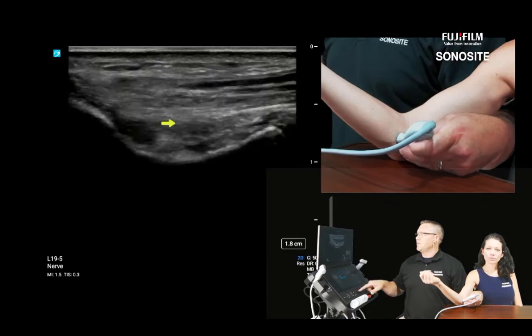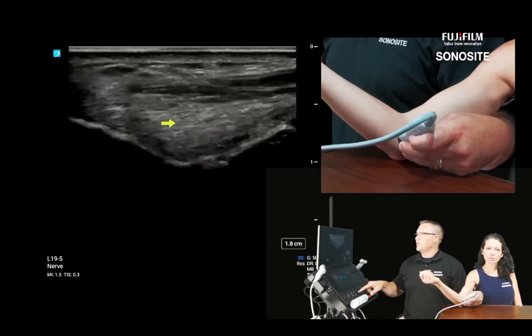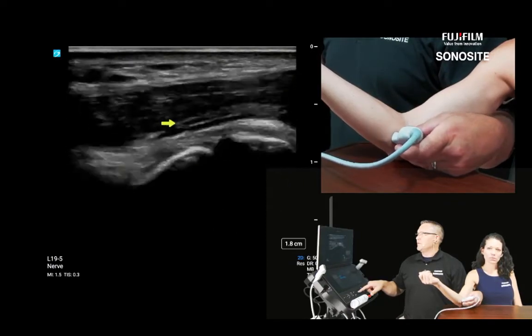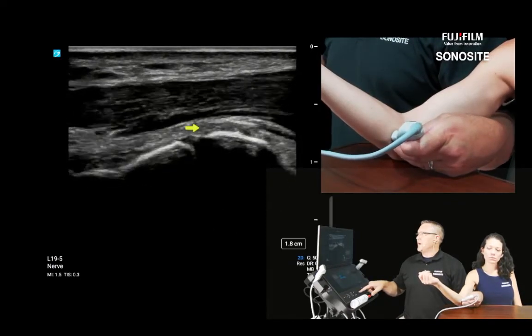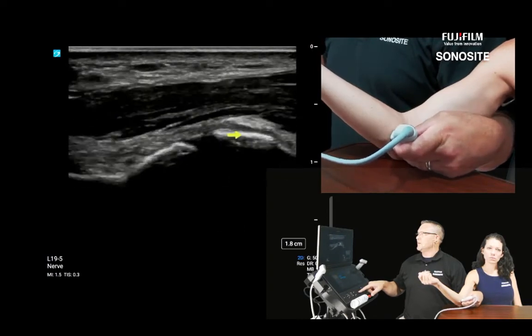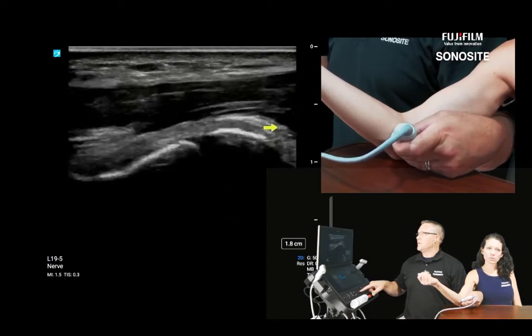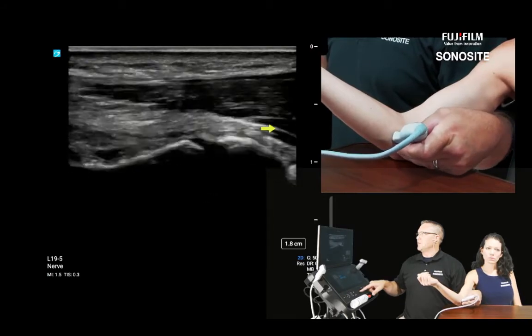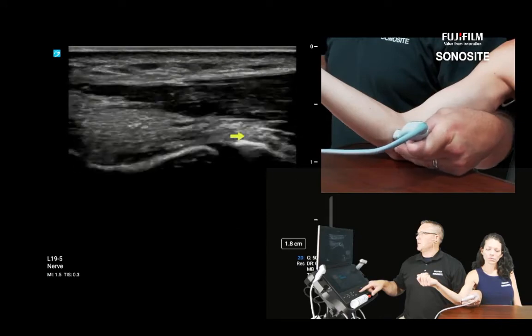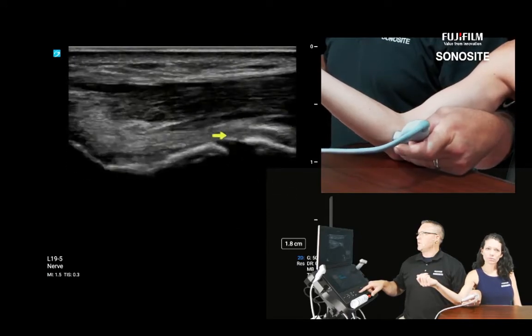We rely on anisotropic artifact because the fibers are so dense, but we don't typically get to almost count these ligament fibers that we're seeing inside here. And then here I am right at that enthesis to the sublime tubercle of the ulna. Looks really, really nice. And I'm sure if I were to toggle my transducer just a little bit more and catch those fibers a little bit more level, we would see a lot more detail.